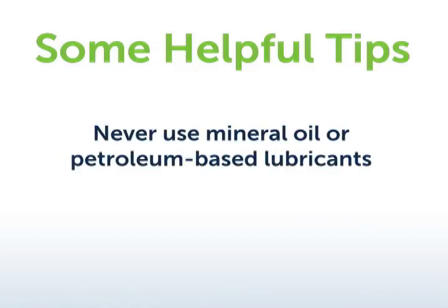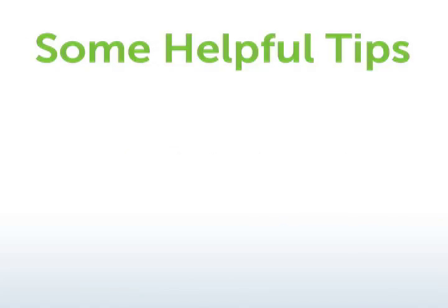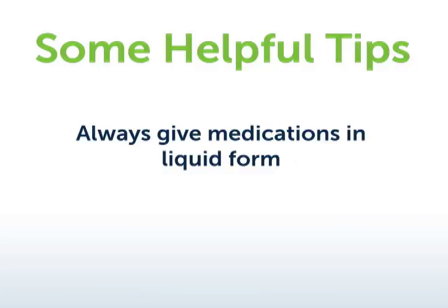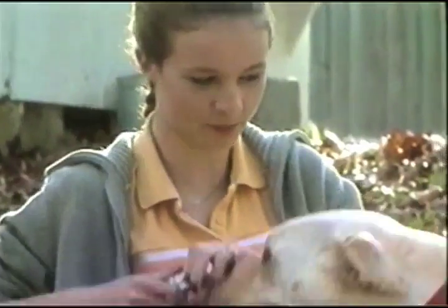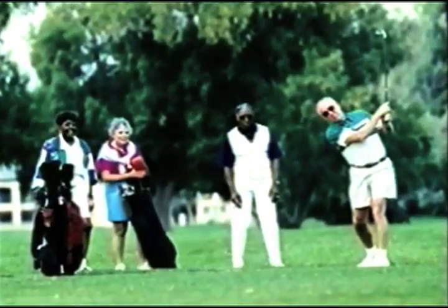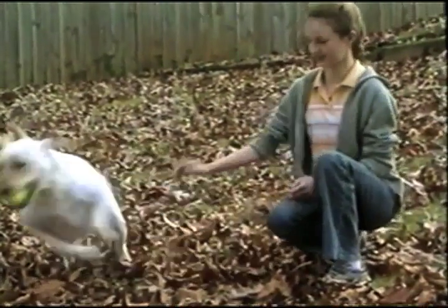Don't use mineral oils or petroleum-based lubricants on or around the tube, as this may shorten the life of the tube. Always give medications in liquid form. When a medication is only available in tablet or capsule form, ask your pharmacist if it can be crushed and mixed with water. Gracie and her family have learned all about the Mickey feeding tube, and so will you. But the most important thing you'll learn is that life with Mickey is not much different from life before Mickey.